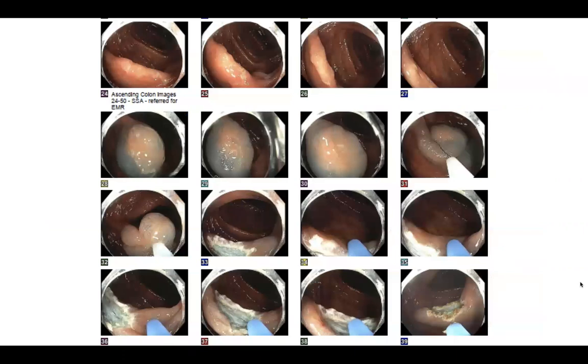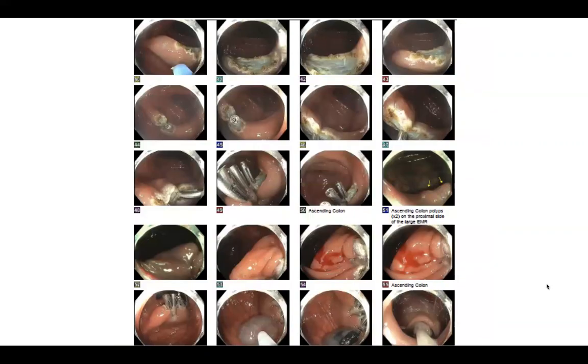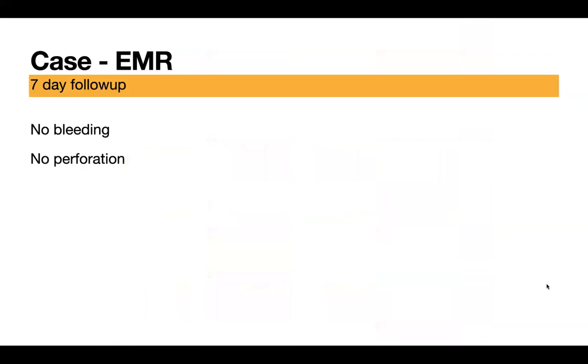And the second thing is, every time you do a resection, big resection, this is not a big resection, but every time you do a resection for somebody who's referred to you, it's important to not only document for the sake of clear documentation, you should take it upon yourself to use that as an education. Your report should help educate others. So that's why you want to include a lot of images that tell a complete story.